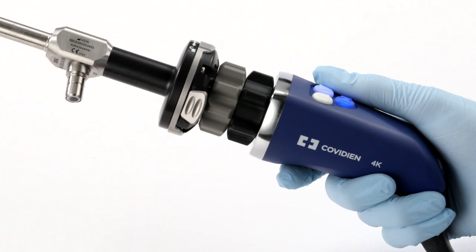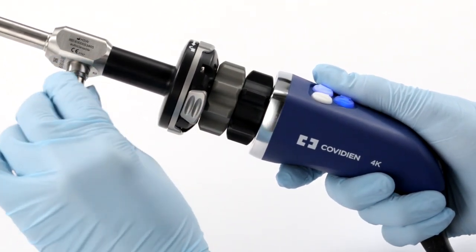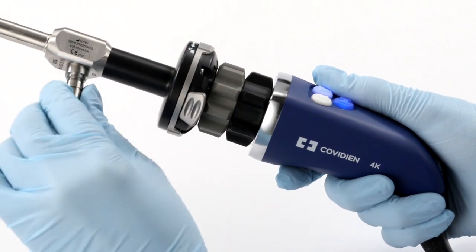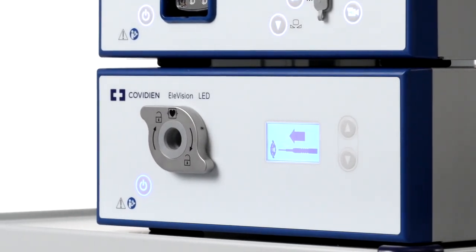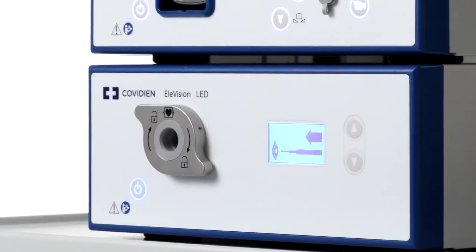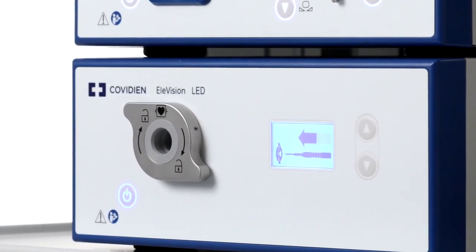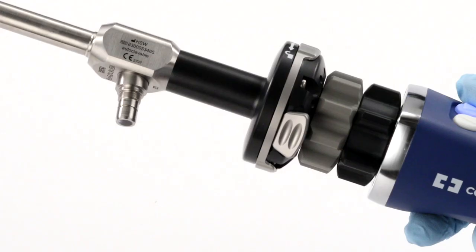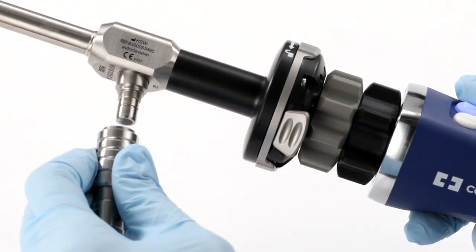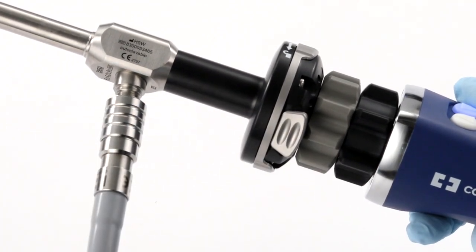Next, connect your laparoscope to the light guide. When connecting a light guide, it is important to note that different light guides require different adapters to connect to the laparoscope. Once you ensure you have the right adapters, make sure the light source is in standby mode. It will be on the front of the device and illuminated in blue. In this mode, the LCD screen will prompt you to enter your light guide. Keep the light source in standby mode until the distal end of the light cable is connected to the laparoscope.